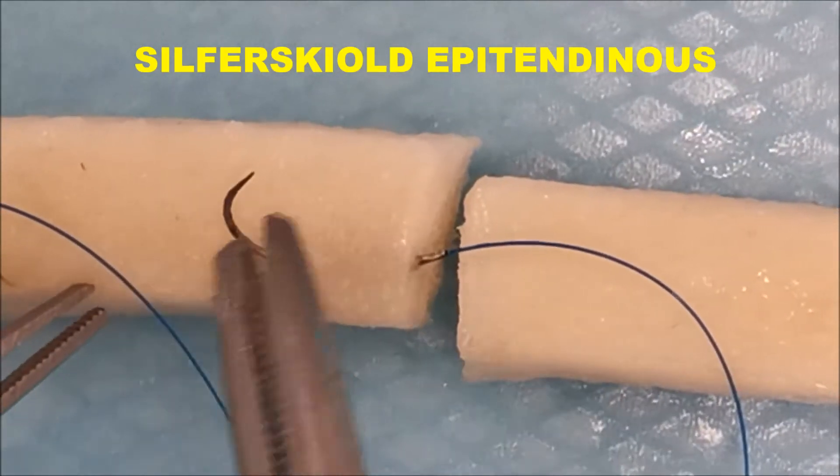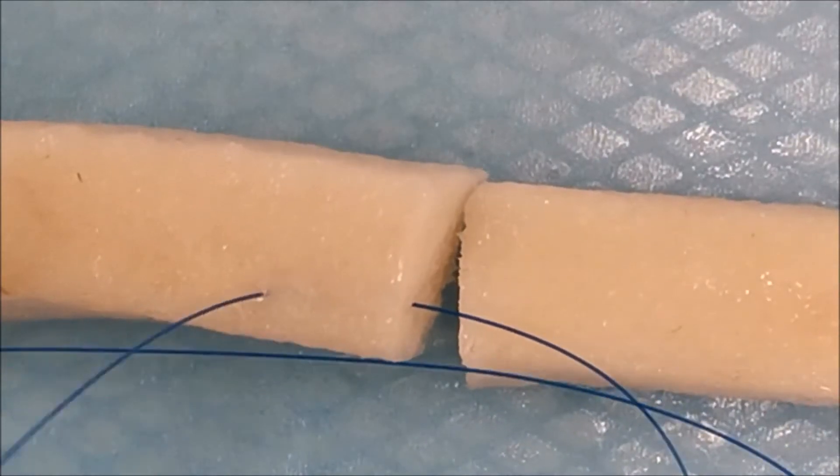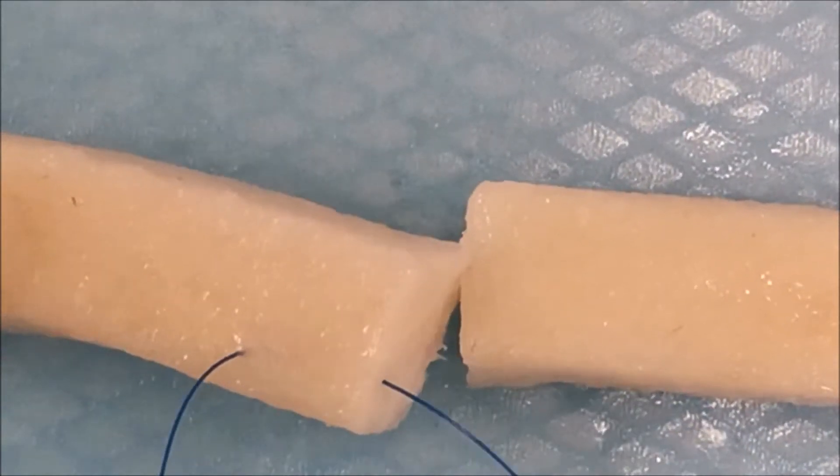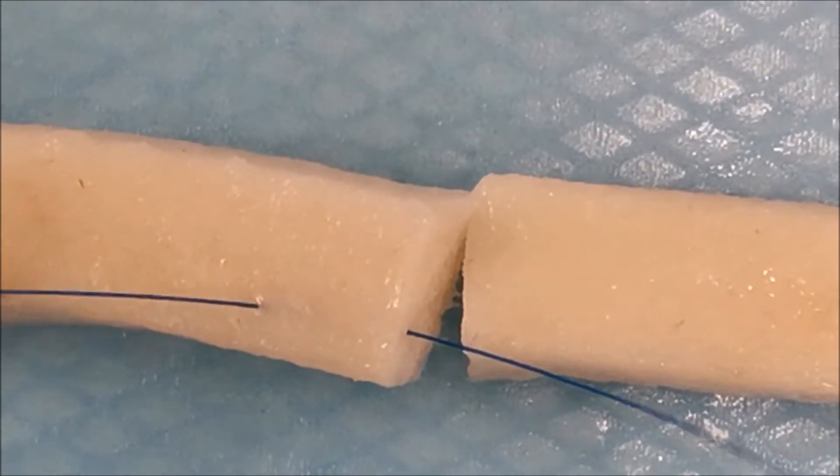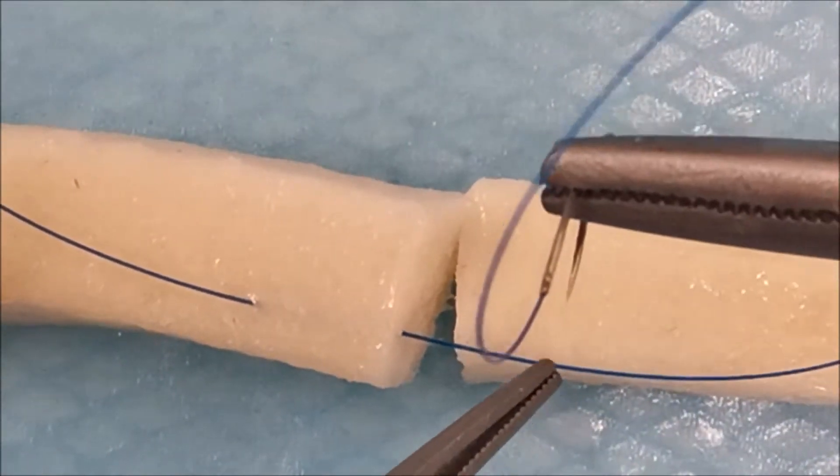For an epitendinous suture, the Silfverskiöld is one option. I like to bury my knot so I start from the inside of the tendon.